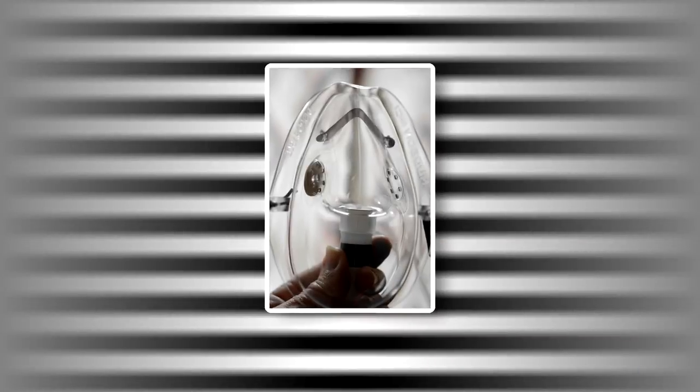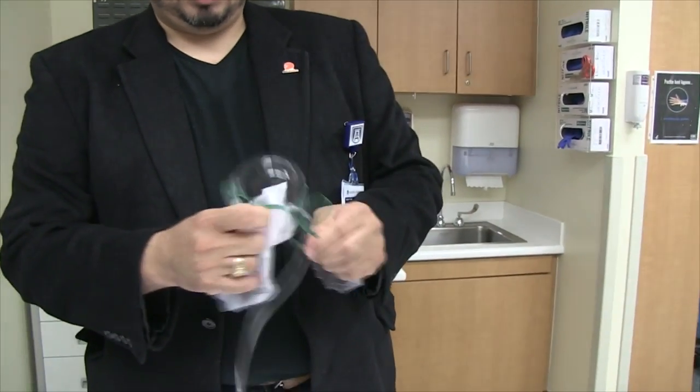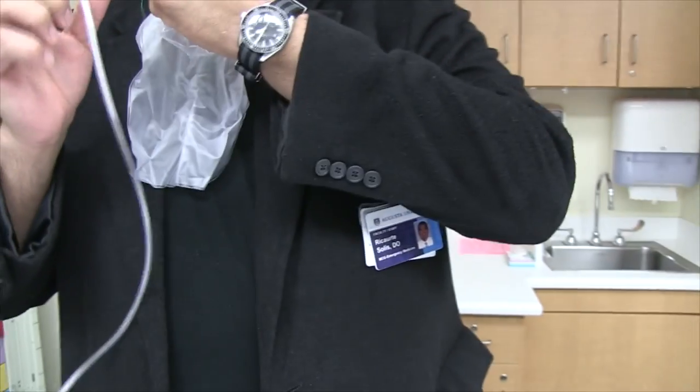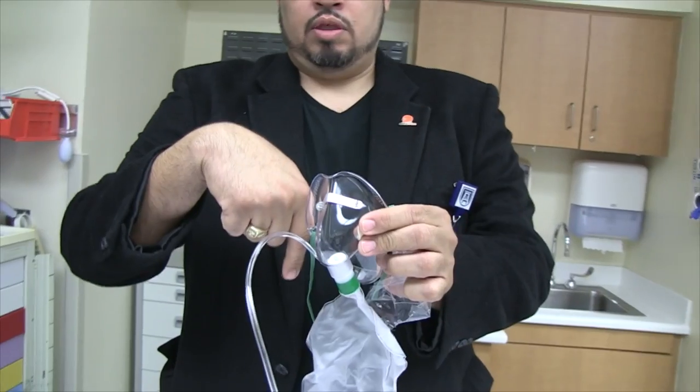It's called non-rebreather because you have this reservoir, which again, you fill with oxygen, right? It has a one-way valve so that oxygen goes from the reservoir into the mask. Right. And if you take a deep breath, this disc will seal so that there's not a lot of room air going into the mask.